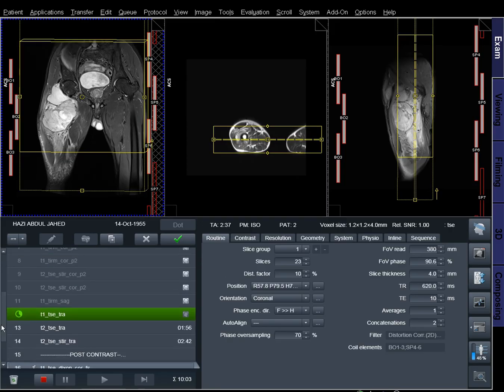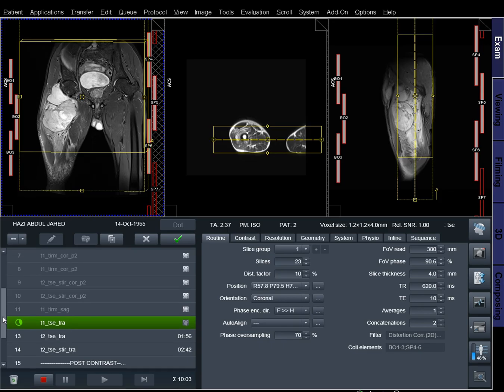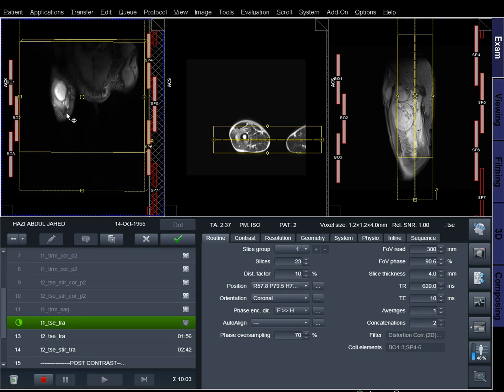Ferromagnetic surgical clips or staples. Metallic foreign body in the eye. Metal shrapnel or bullet.